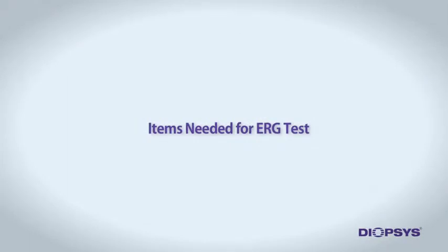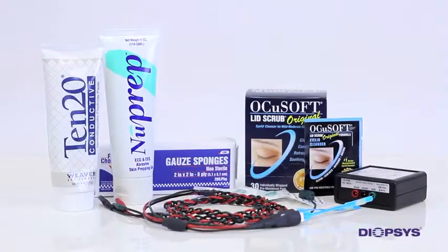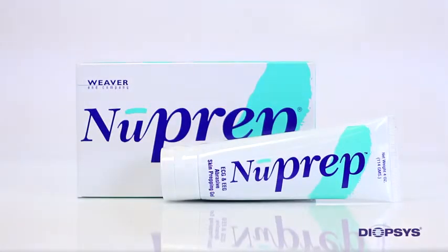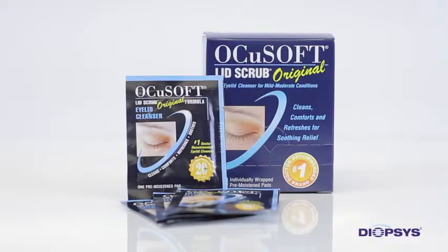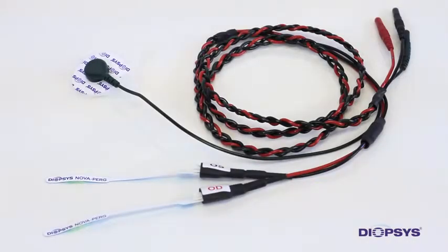To save you time, it is helpful to have all testing supplies within arm's reach before bringing the patient into the testing room. Be sure to have the following items ready: clean gauze, the tube of NuPrep gel, the tube of 1020 conductive paste, one disposable EEG electrode, lid scrub pads, two disposable ERG lid electrodes, and the ERG lead wires.